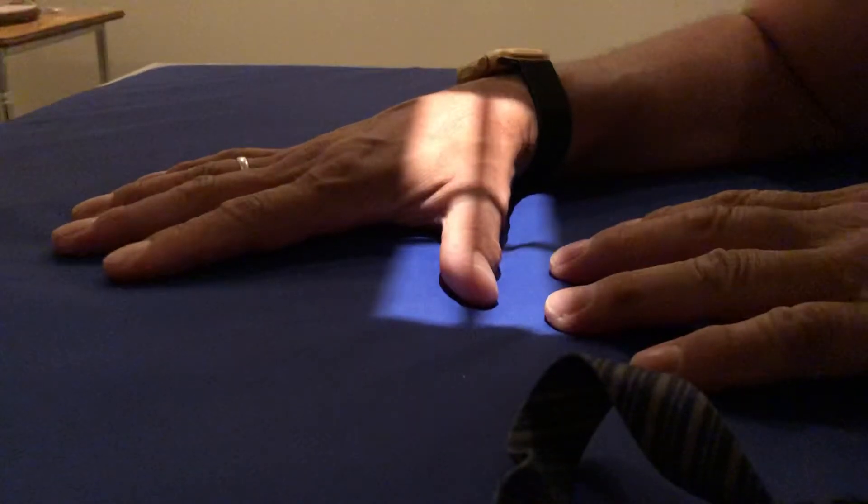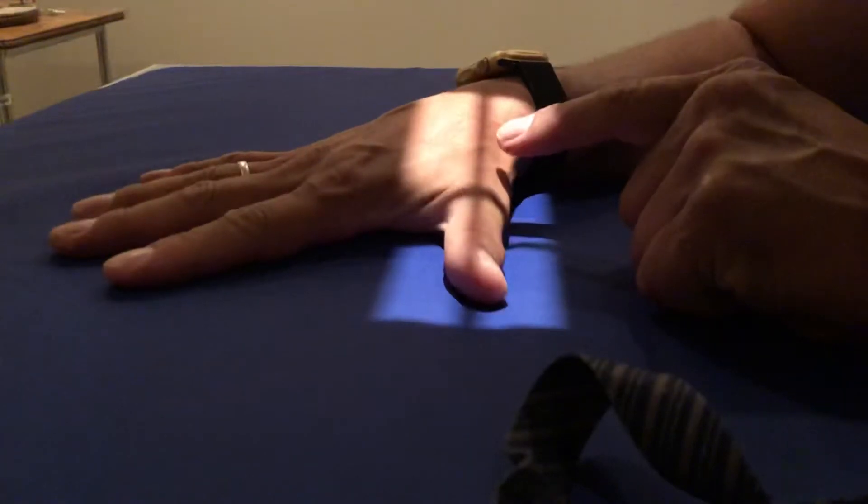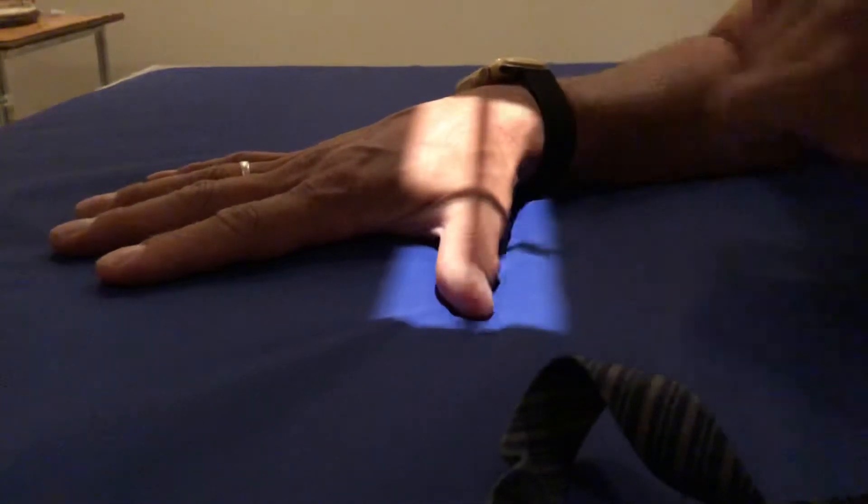I'm not going to put a marker on here. I'm going to just describe it in regular terms. So you're going to center at the base of the thumb. First one is just going to be flat on the table, and by doing that, you get the thumb in a nice 45-degree angle. So you take the exposure like this.